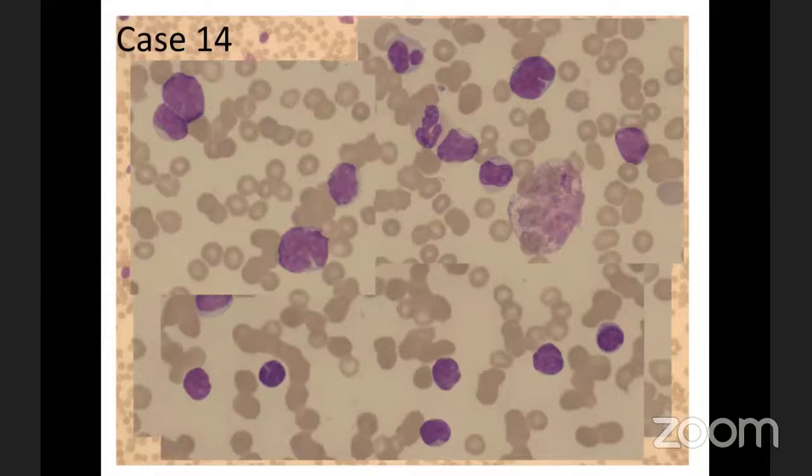And of course, you need to run your immunophenotyping to confirm these assumptions and send for a FISH for the 11;14 translocation. The thing is that some cases will look like a CLL by morphology, where you will have only the small mature looking lymphocytes, and the flow cytometry is the diagnostic.